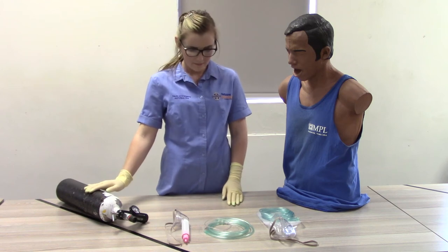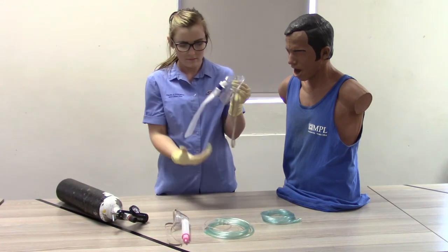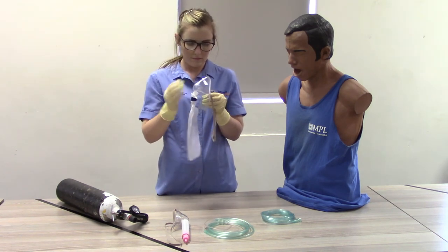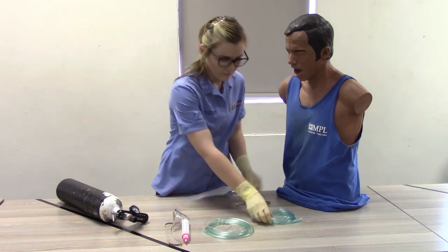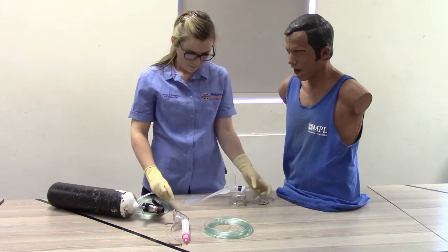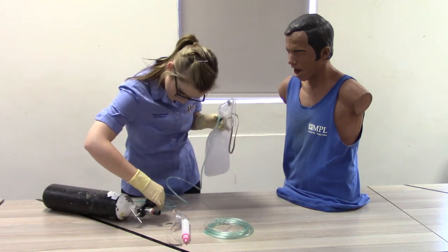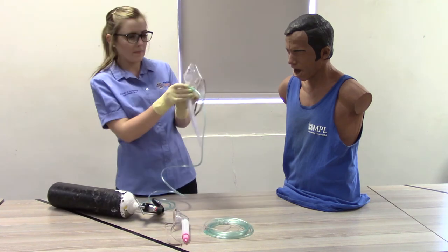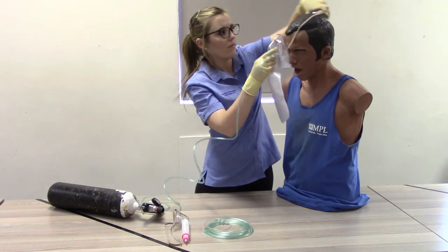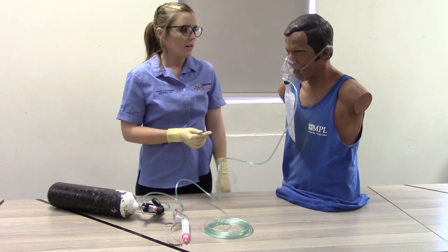Select the suitable oxygen delivery device for the patient. Ensure that the oxygen delivery device is complete and undamaged. Connect the tubing from the cylinder to the oxygen delivery device. Open the flow regulator to the required flow rate. Apply the oxygen delivery device to the patient's face and ensure a snug fit.